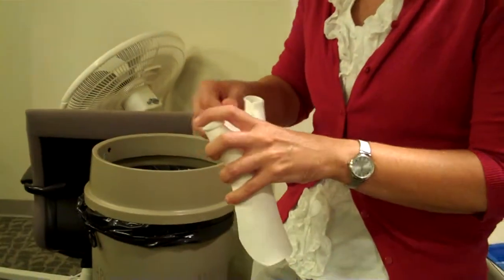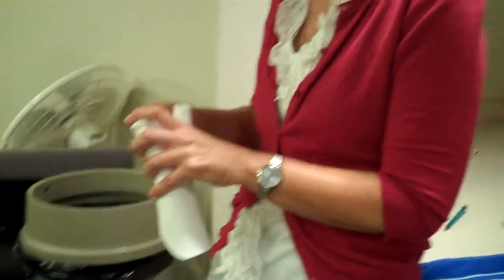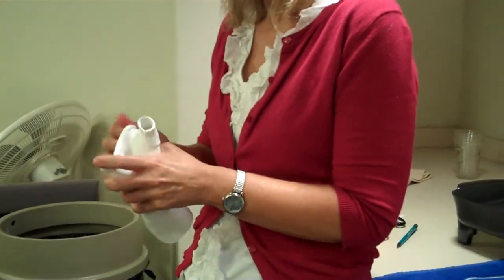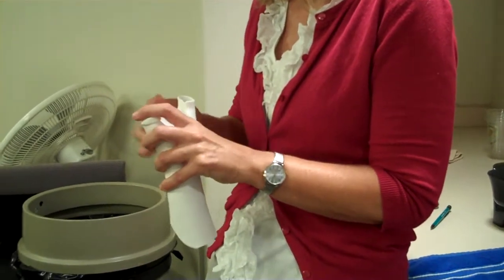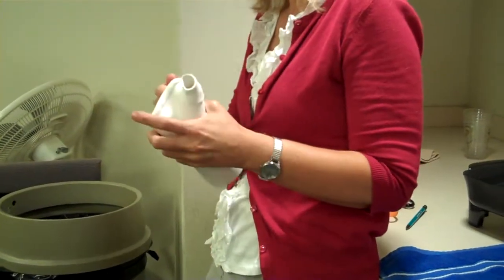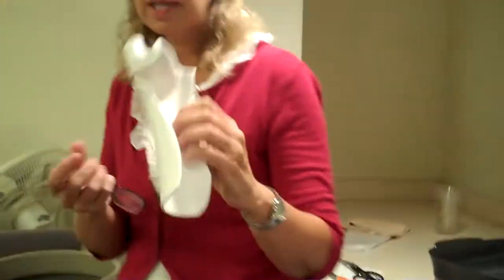And always make sure your splint pan's turned on. I don't know how many times I've gotten ready to make a splint and the pan wasn't turned on. And then you're sitting there having to make small talk for 20 minutes. Is that how long it takes to heat up? 20 minutes? I think so. Well, these are new, so they're working pretty good, but those resources in the clinic aren't always great.